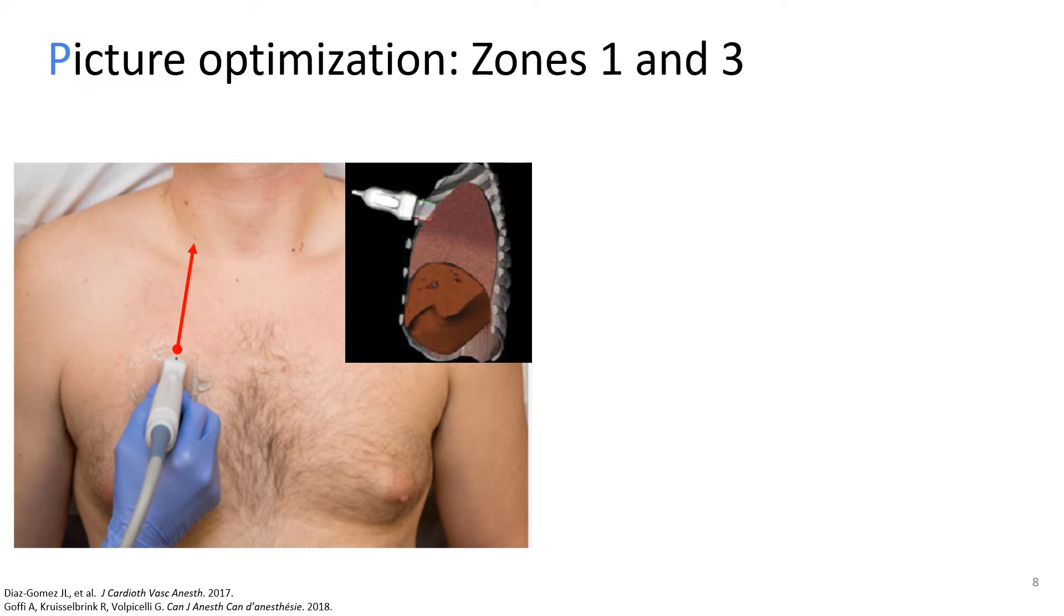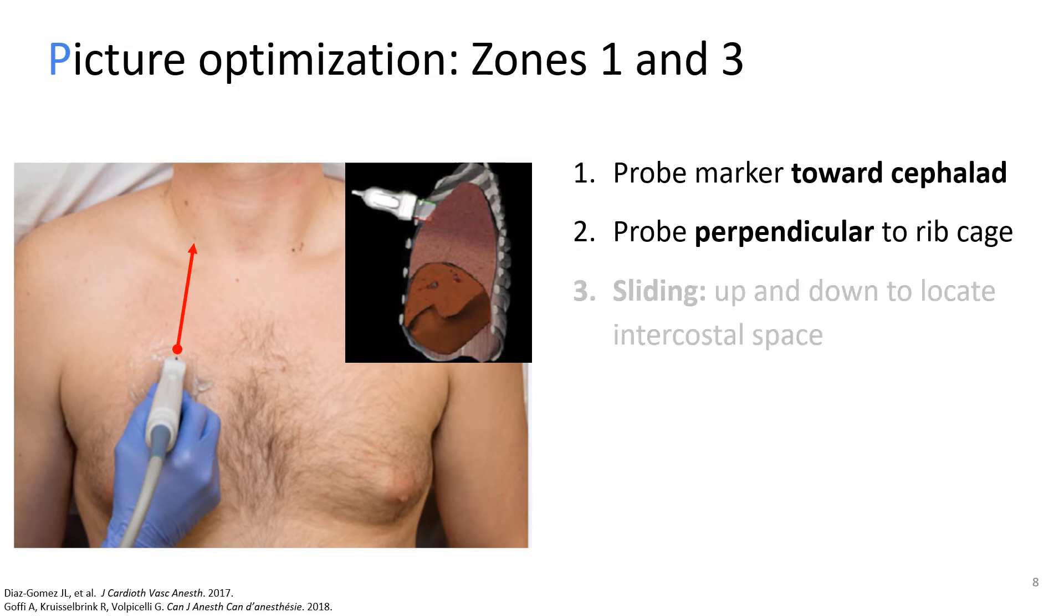Let's start with tips for scanning over zone one and three. First, make sure the probe marker is pointing towards cephalad or 12 o'clock. As you can see here, the red arrow represents the orientation of the probe marker. Generally speaking, for lung ultrasound, the probe indicator should always point towards 12 o'clock. Second, the probe must be perpendicular to the chest wall or rib cage. And third, you can slide the probe up and down until you are located over an intercostal space.